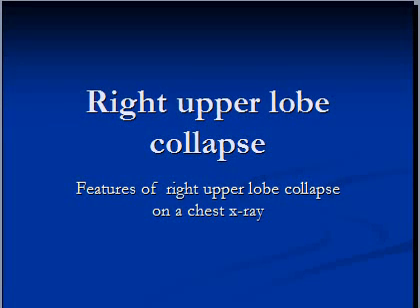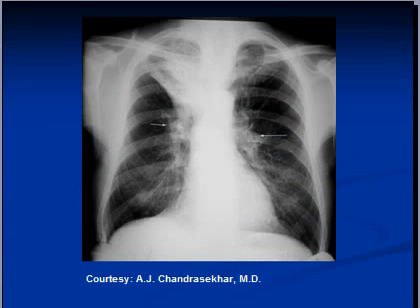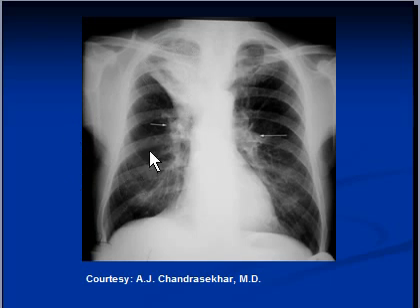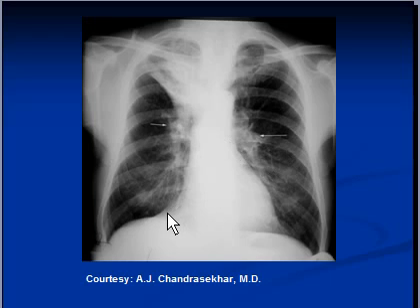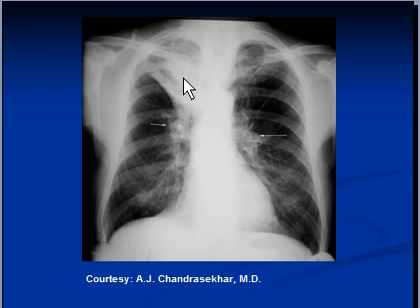Features of right upper lobe collapse on chest X-ray. On the PA view, there is a triangular opacity in the right apex. The right lung is a bit smaller than the left lung. Arrows indicate that the right hilum is slightly higher than the left hilum. The opacity does not show any air bronchogram.